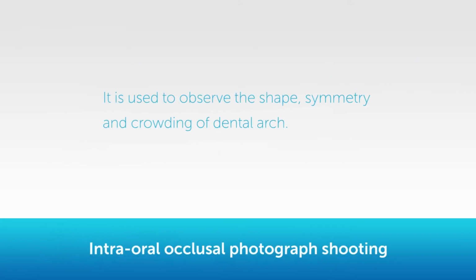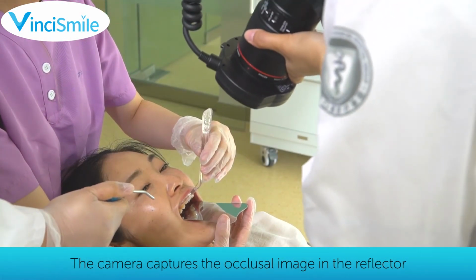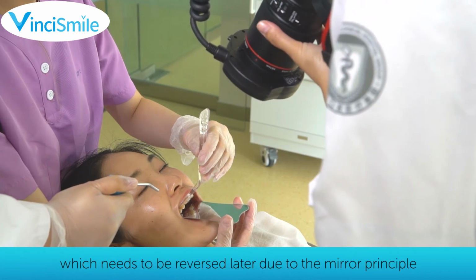Intra-oral occlusal photograph shooting. It is used to observe the shape, symmetry, and crowding of dental arch. The camera captures the occlusal image in the reflector, which needs to be reversed later due to the mirror principle.